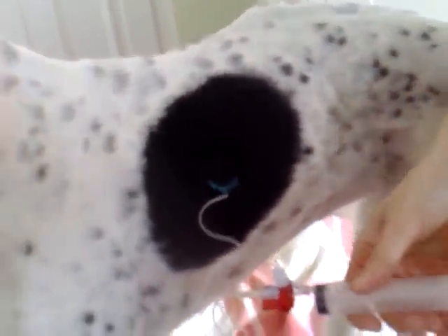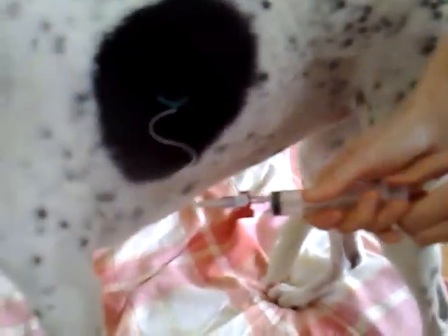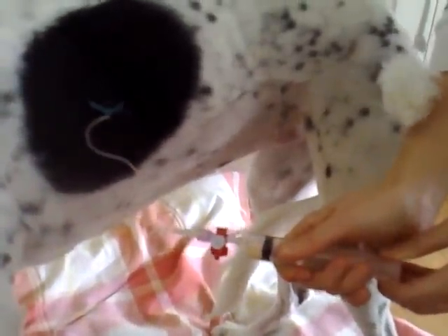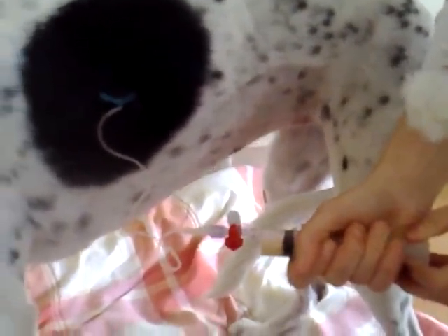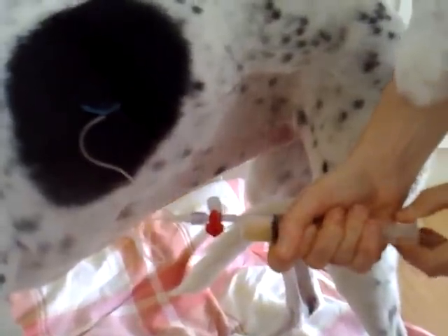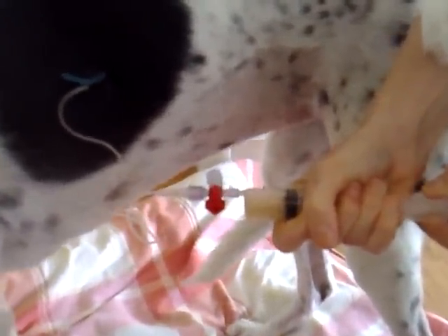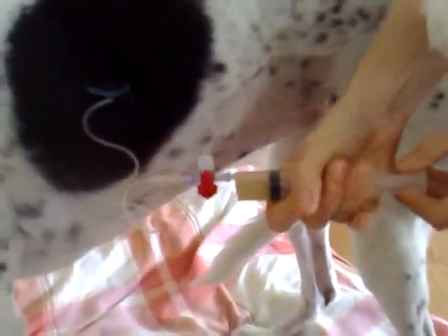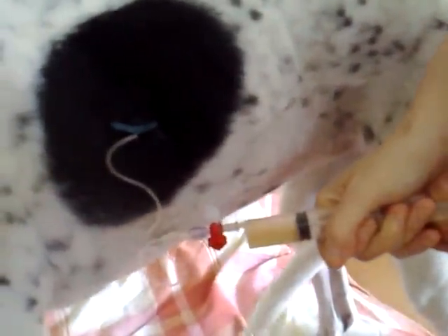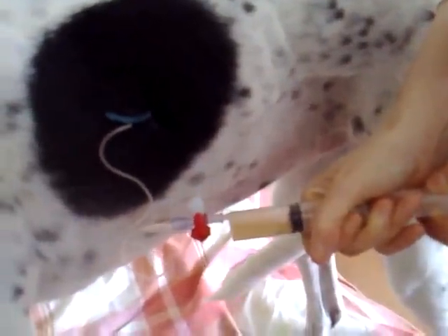Once it's in position you can begin to drain back fluid. Pulling steadily back, this will relieve the pressure in the pleural space.